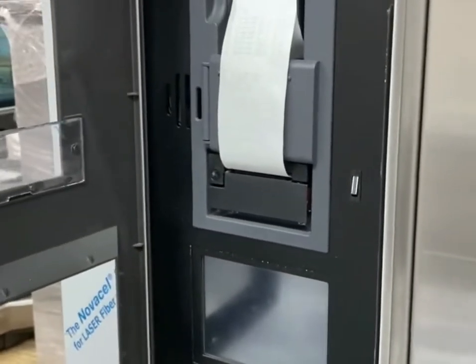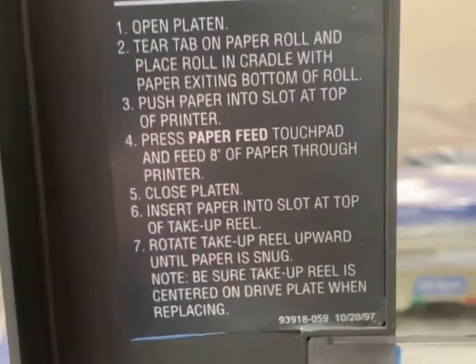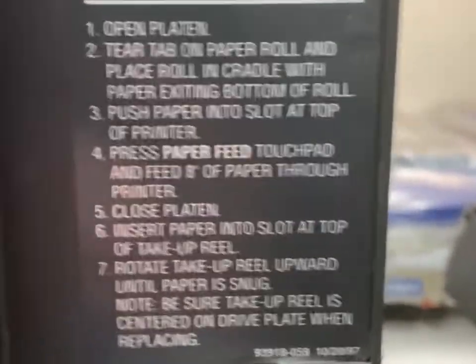Opening the display panel where the printer is located. On the inside there is a step-by-step instruction as to how to change the printer — it's fairly simple.